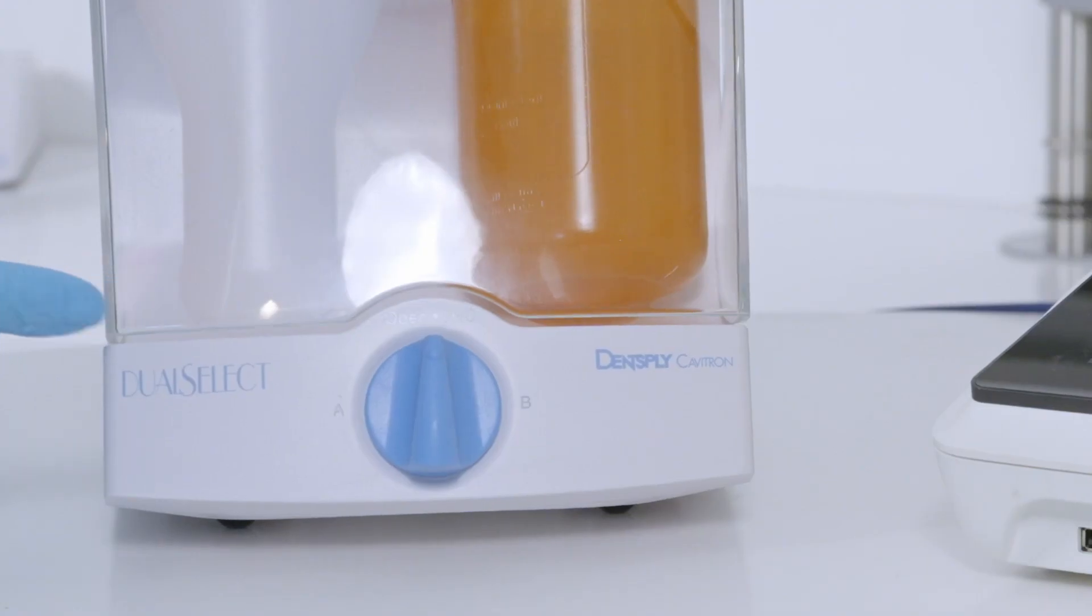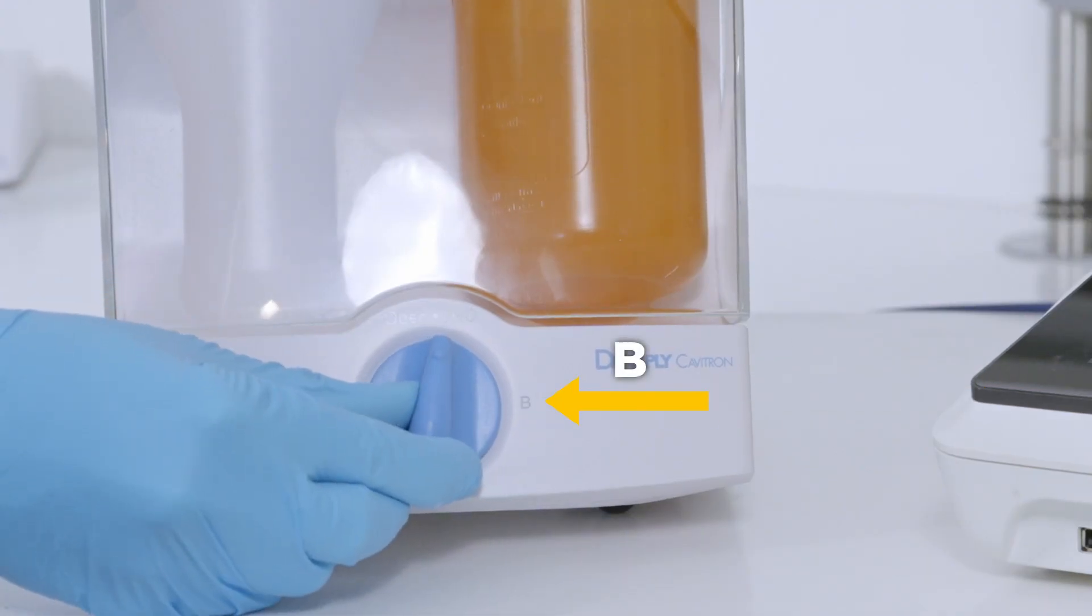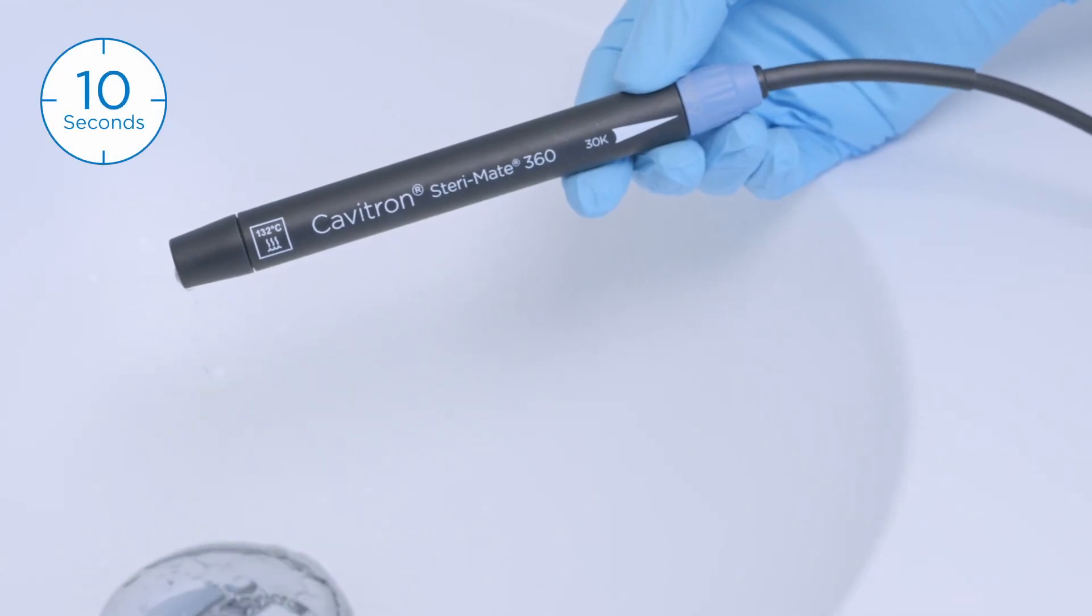Switch selector knob to position B and operate the unit for at least 10 seconds.